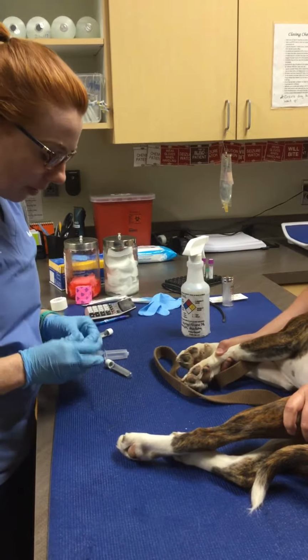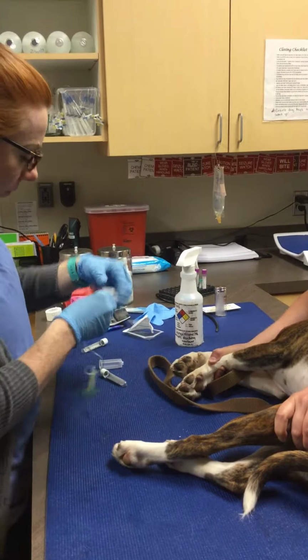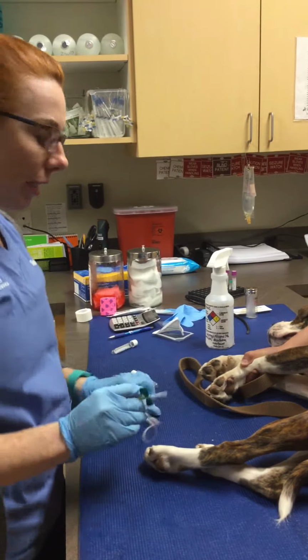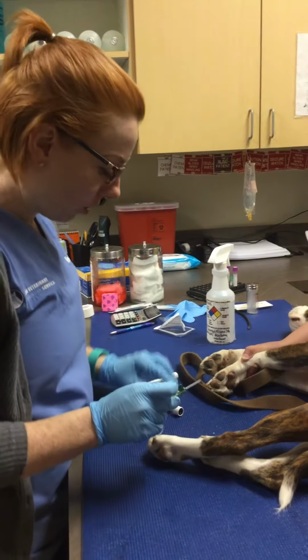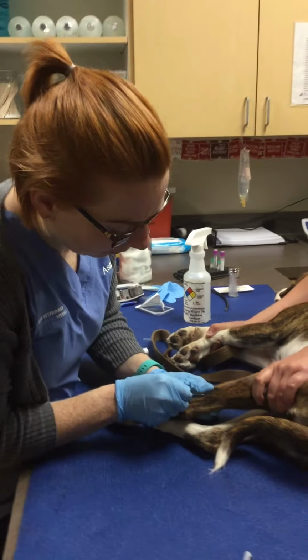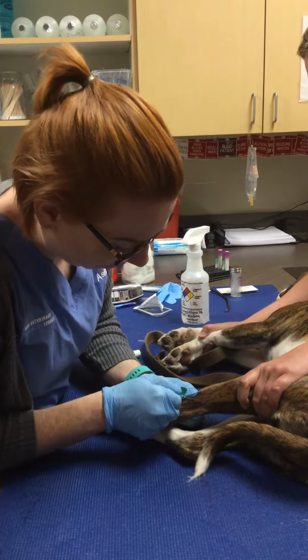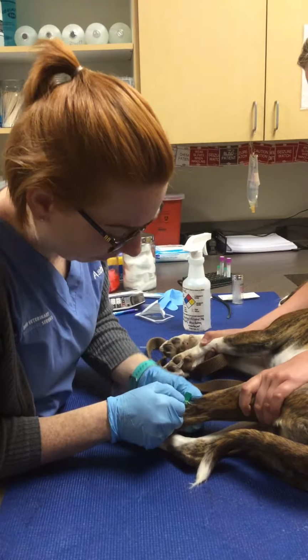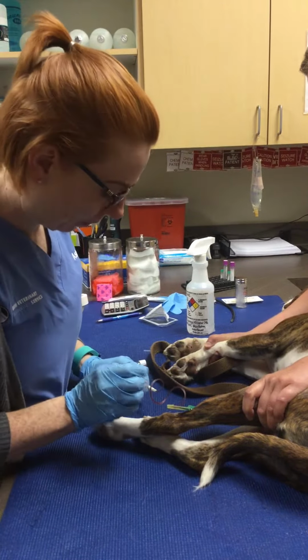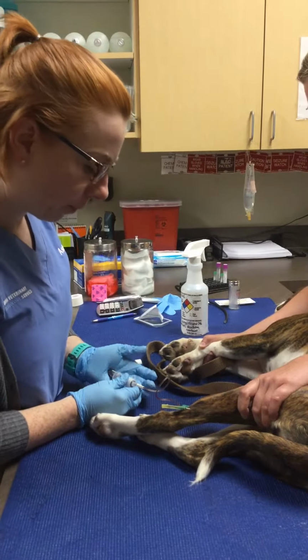I'm going to use a vacutainer. So I'm going to pull and fill 1 tube up, discard it, and then pull 2 mLs in the tube that I'm going to use for the test. So the first one going in, and I'm going to discard this one.